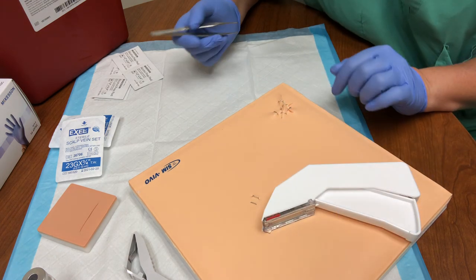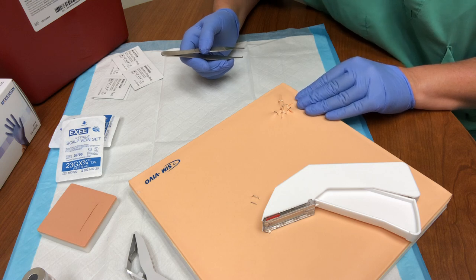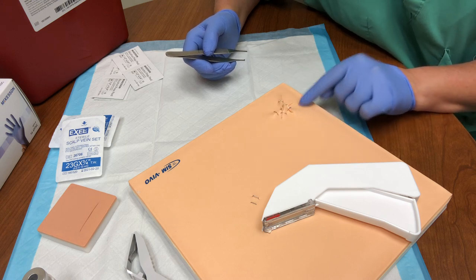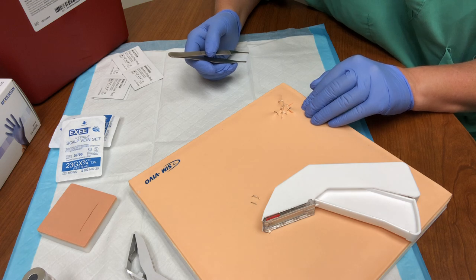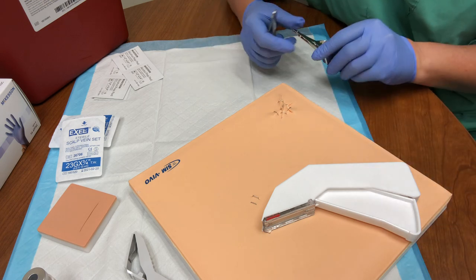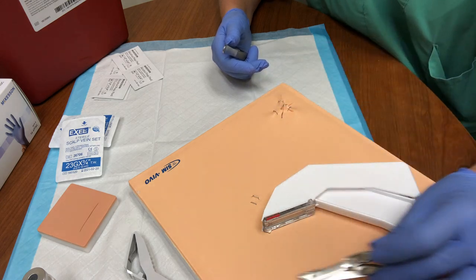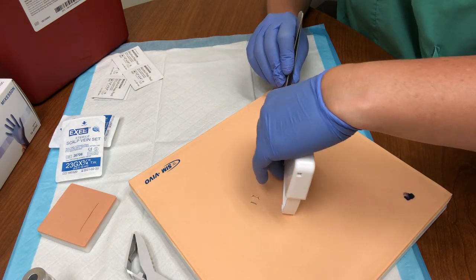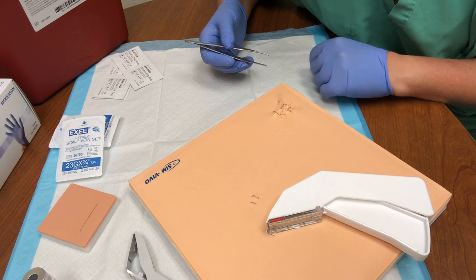These wounds are always difficult to close. As a preceptor I've seen students come into rotation, look at this stellate laceration, and not know where to start — primarily because they're so focused on trying to go with the rule of halves, not appreciating that in this scenario that does not work well. So you really just try to pull as many of the pieces together as possible. Never be afraid to remove a staple if you don't like how it looks — just bring a staple remover, take the staple out, place it in your sharps container, and go ahead and re-line that area up and re-approximate.